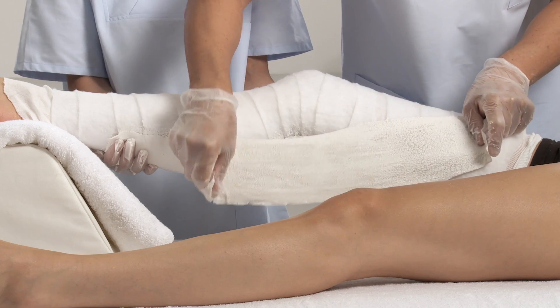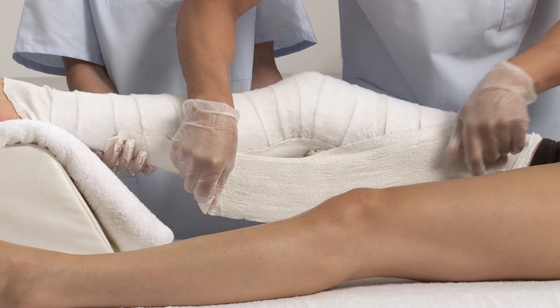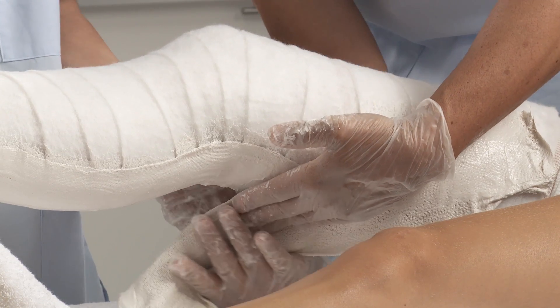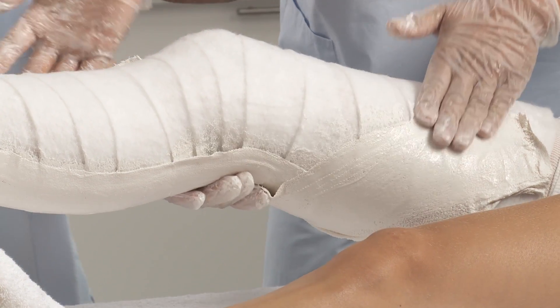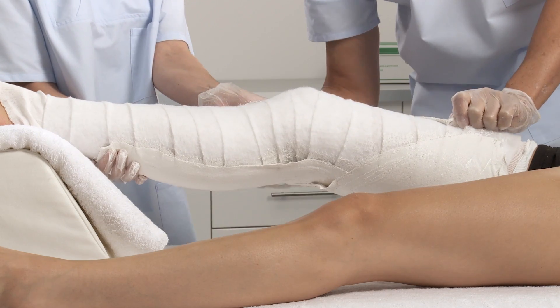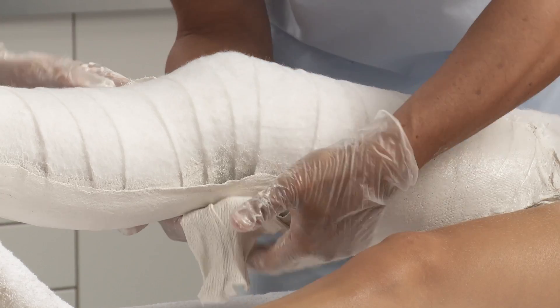Apply a second splint by placing it onto the inside of the thigh, across the back of the knee and along the outside of the lower leg. Use a third splint and apply it to the outside of the thigh, criss-crossing it with the other splint.